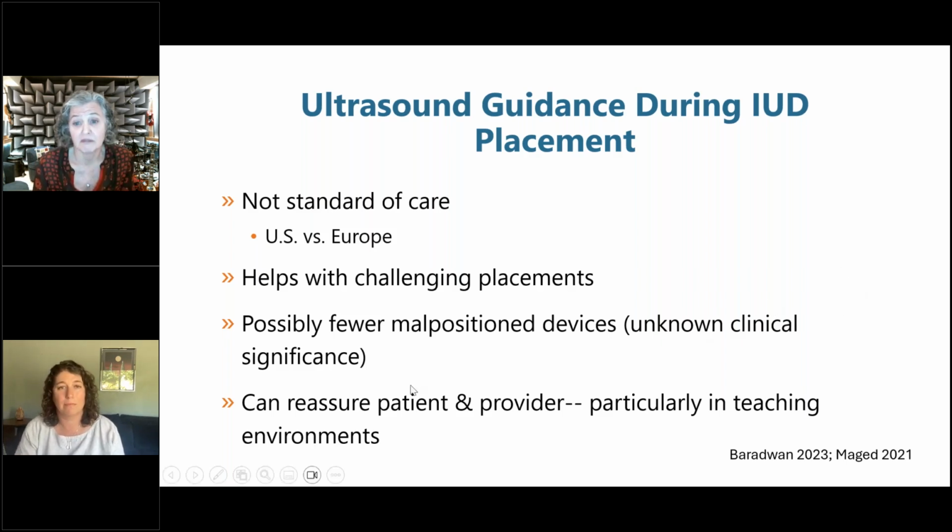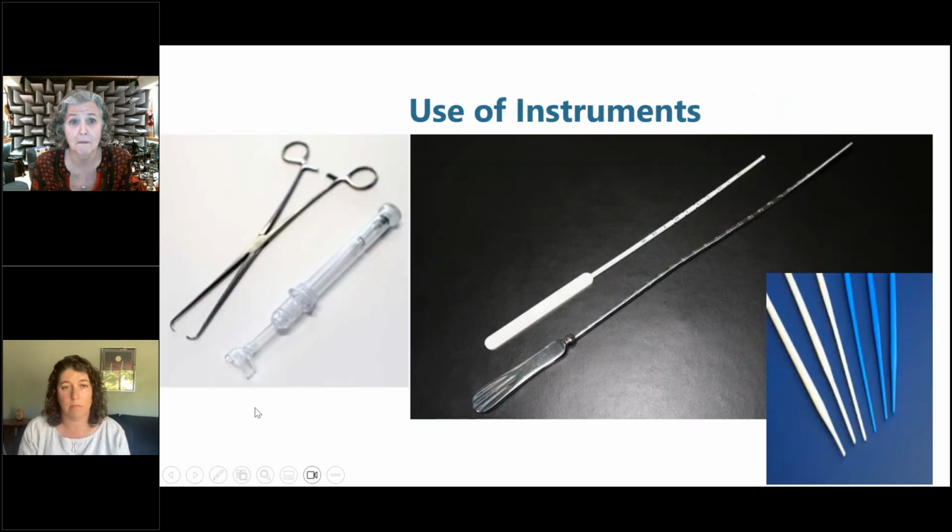Also, this is great for teaching, by the way, for those of you in a teaching environment or who have people that are coming into your office as trainees or having preceptorships, then it's very helpful to be able to use an ultrasound in those cases.